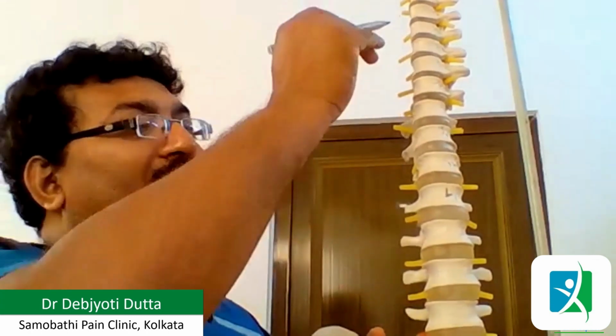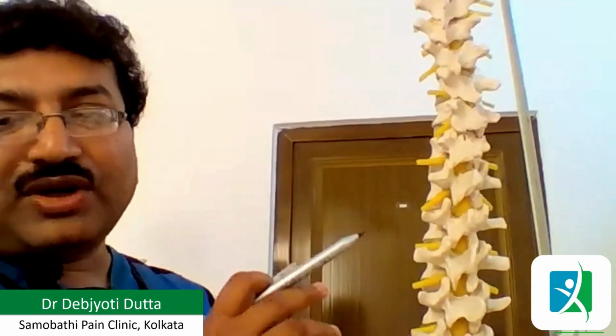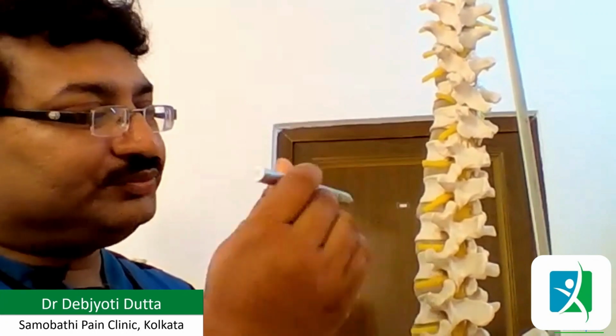So from behind, it is coming towards the anterolateral side, and then, as you all know, the chains of both sides join together below, forming the ganglion impar. So to block at the lumbar sympathetic level, we need to go to the anterolateral corner of the vertebra. Now, if we think that we are coming from the back, how can we see what structures we have to go through and where we need to go?